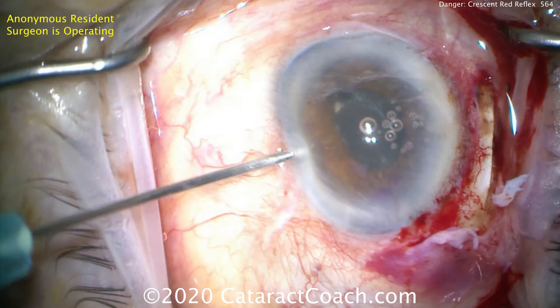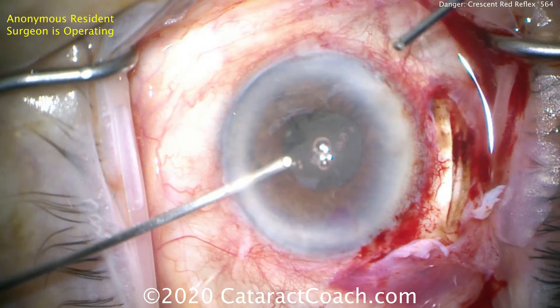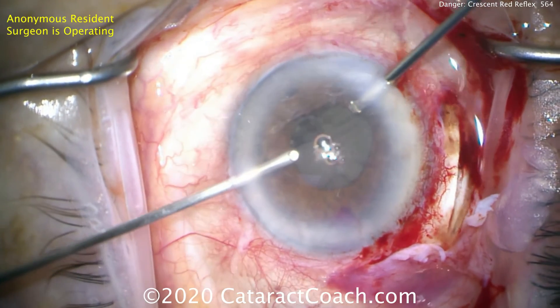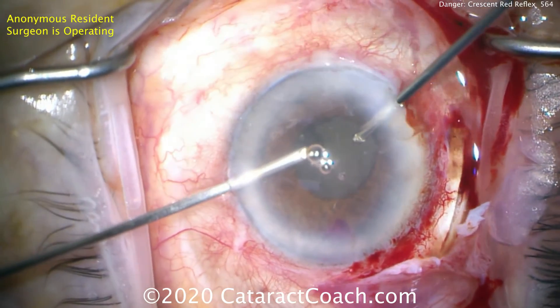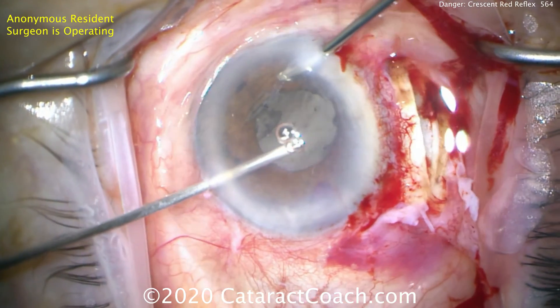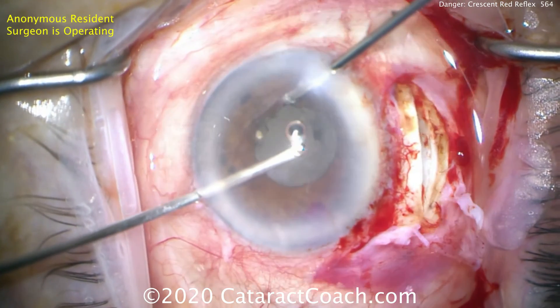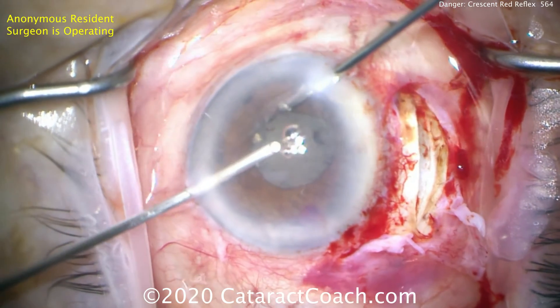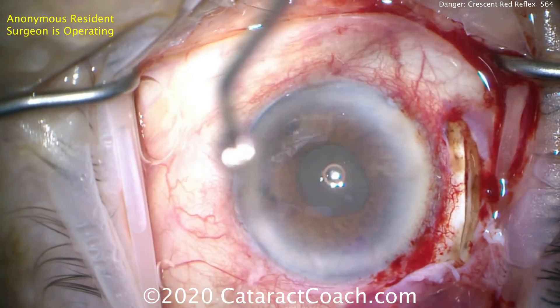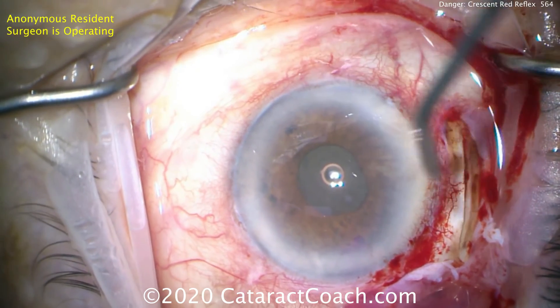Getting the nucleus out of the eye — there it goes. Now we can clean up a little bit, doing a bimanual anterior vitrectomy with 23-gauge vitrectomy. The entire lens capsule came out of the eye as well, so there's no zonular support now. We put in triamcinolone — that's that white reflex you see. A lot of triamcinolone went inside the eye; that helps stain any of the vitreous. We'll take our time and do a nice thorough anterior vitrectomy. The pupil comes down nicely; we put a little bit of Miochol inside the eye to achieve that.